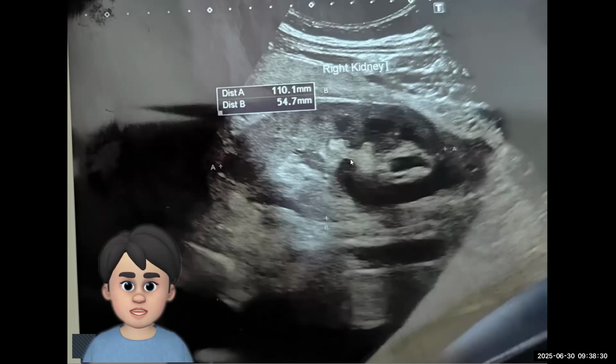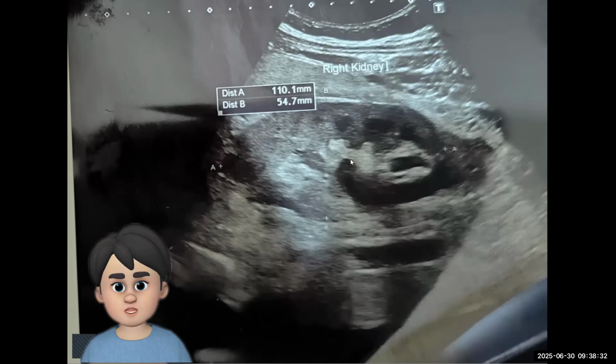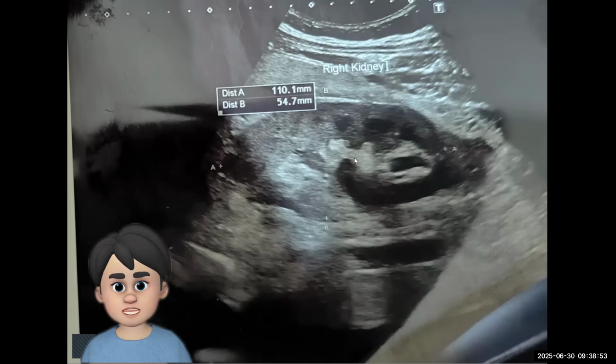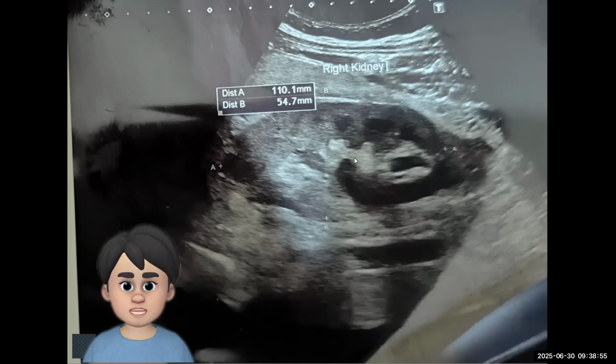In that patient, what we reported was mild hydronephrosis. You can research it, but since you may not yet know how to identify these structures: this is the right kidney, and these are the renal calyces. Hydronephrosis has many causes: obstruction, anatomical abnormalities such as UPJ obstruction and VUR, sometimes pregnancy, neurological causes, and prostate issues. That patient had unilateral hydronephrosis, but sometimes you get bilateral hydronephrosis also.